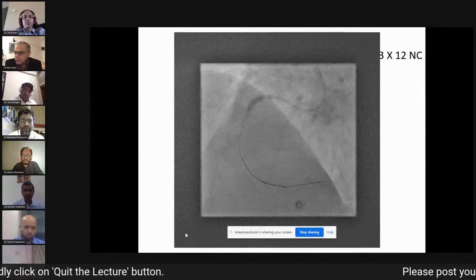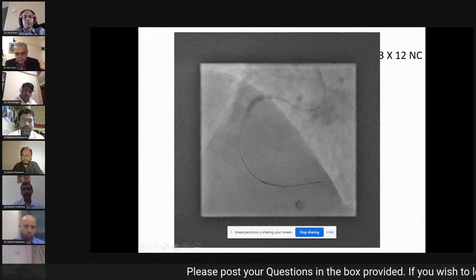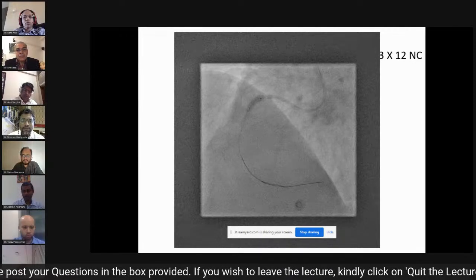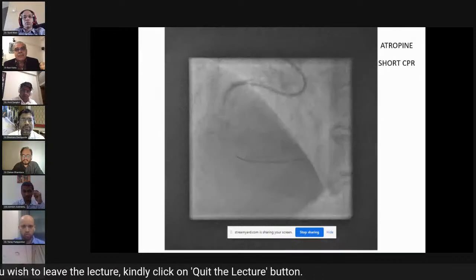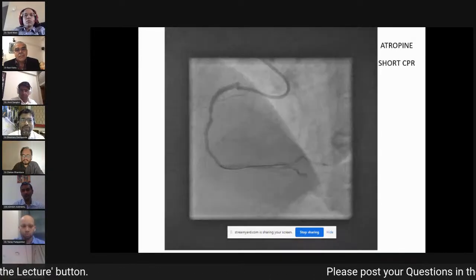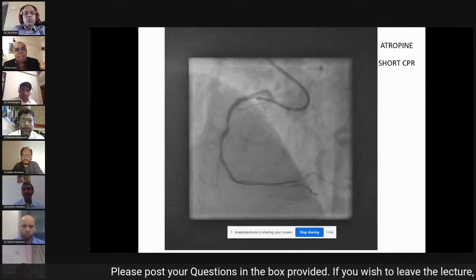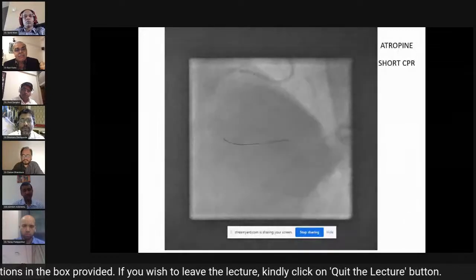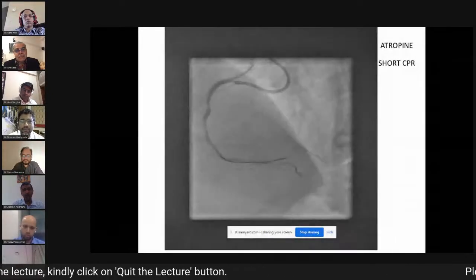Here a problem happened. Basically, after this dilatation near the ostium and with some guide sucking in, there was sudden bradycardia. Probably there was a spasm of the RCA after this event, and the patient went into progressive bradycardia. One operator had to stop and start CPR. The anesthetist was there at the head end. He gave atropine, and other operators started putting in the temporary pacing wire. We already had a venous sheath in place, fortunately.